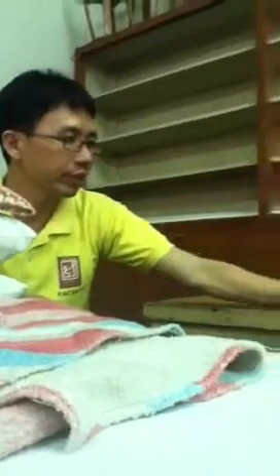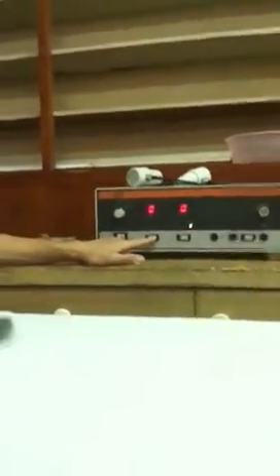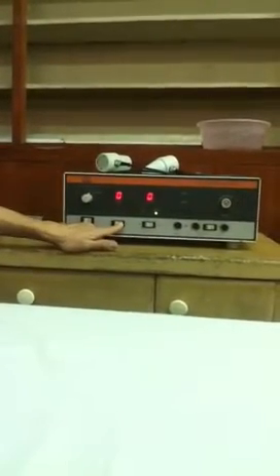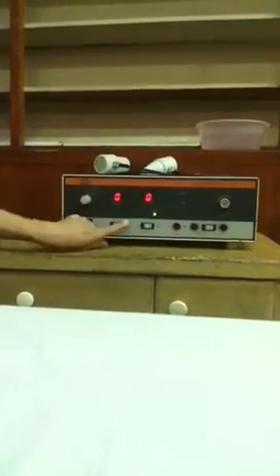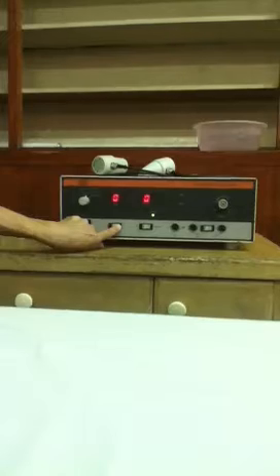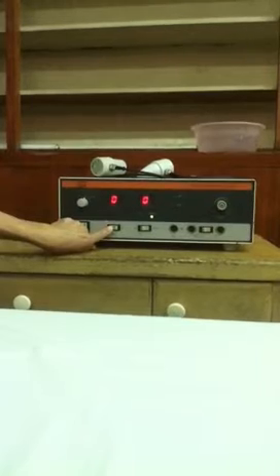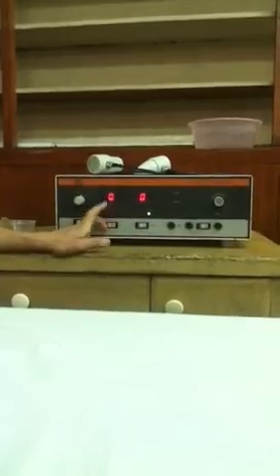Okay, how to adjust this time? You just use this adjustable select switch, in minutes. Arrow up means increasing the time, arrow down means decreasing the time. If you want to increase it, you just press that. Pressing it steadily reduces the time down. So this is what is used to adjust the time. Next, this one is the display.